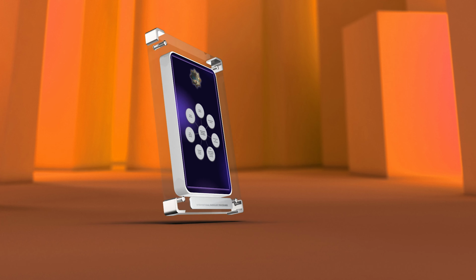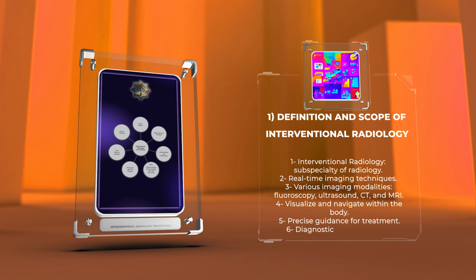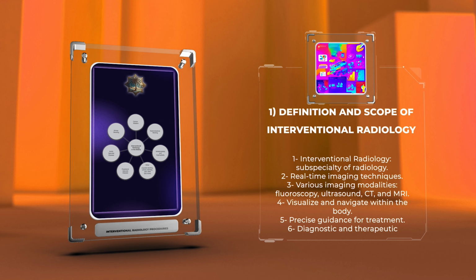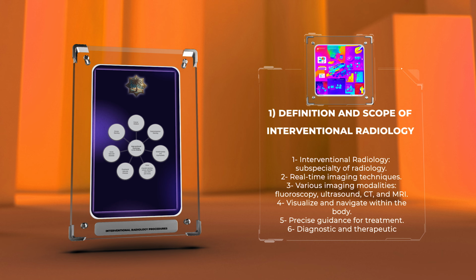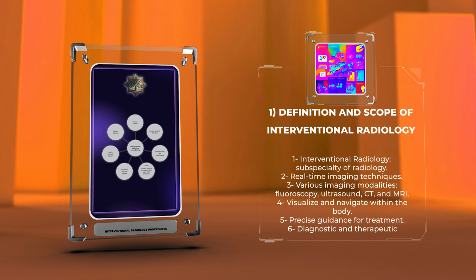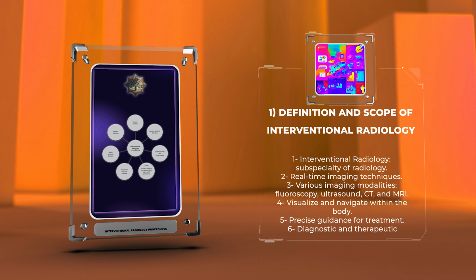Interventional radiology can be defined as a subspecialty of radiology that employs real-time imaging techniques to guide minimally invasive procedures. It involves the use of various imaging modalities, such as fluoroscopy, ultrasound, CT, and MRI, to visualize and navigate within the body, providing precise guidance for treatment. The scope of interventional radiology is vast, covering both diagnostic and therapeutic procedures across multiple organ systems.